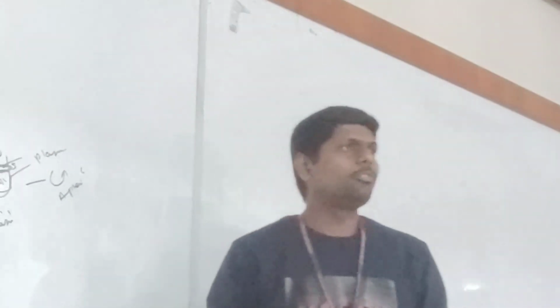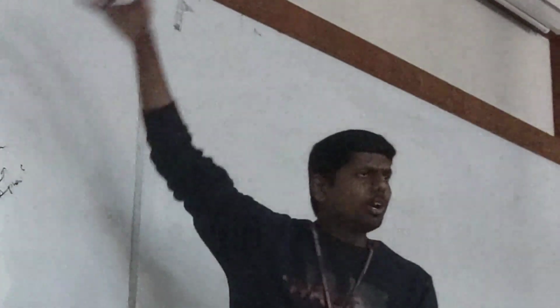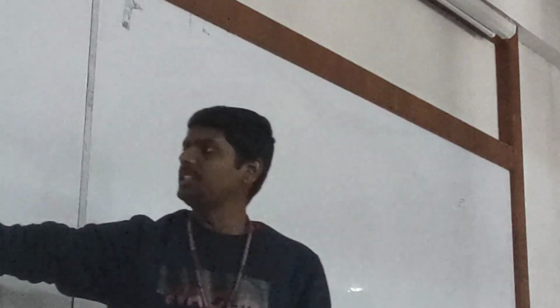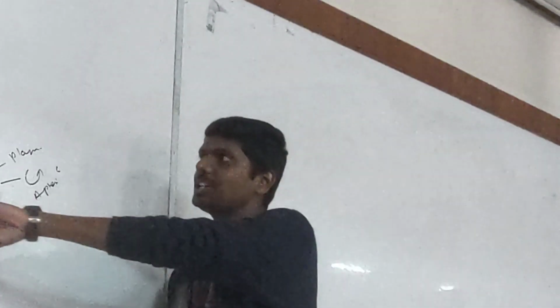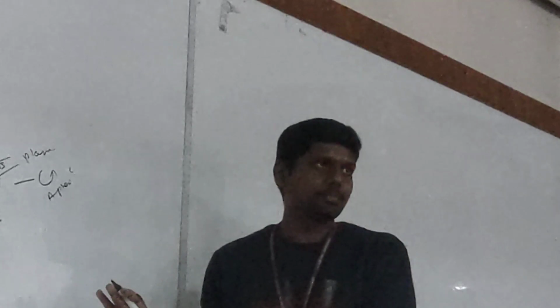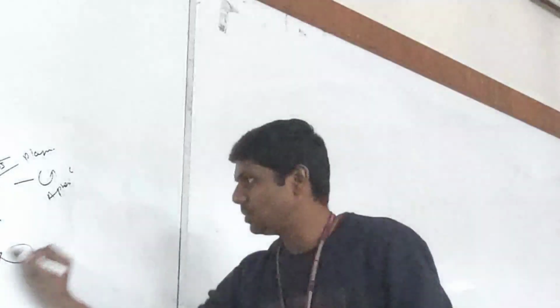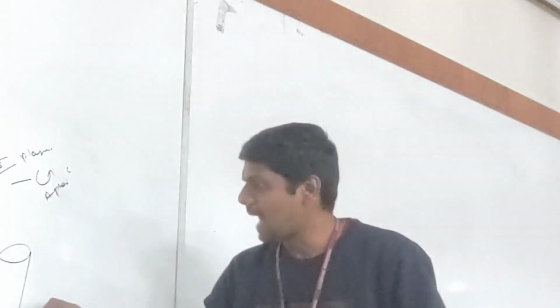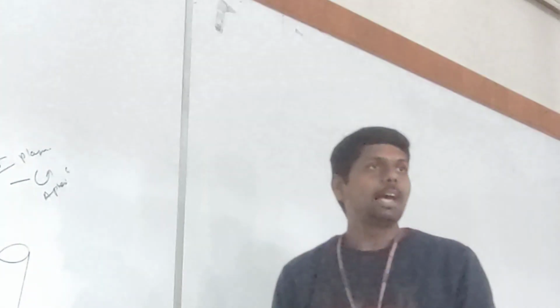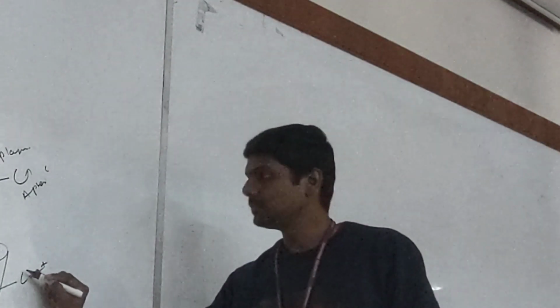For this test, I removed calcium from the blood. The sodium citrate removes calcium first of all. Since I removed calcium, my blood is not clotted. Am I correct? Now I took an unclotted blood. Imagine this is a test tube. In this test tube, I have platelet poor plasma, and there is no calcium. Calcium was removed.